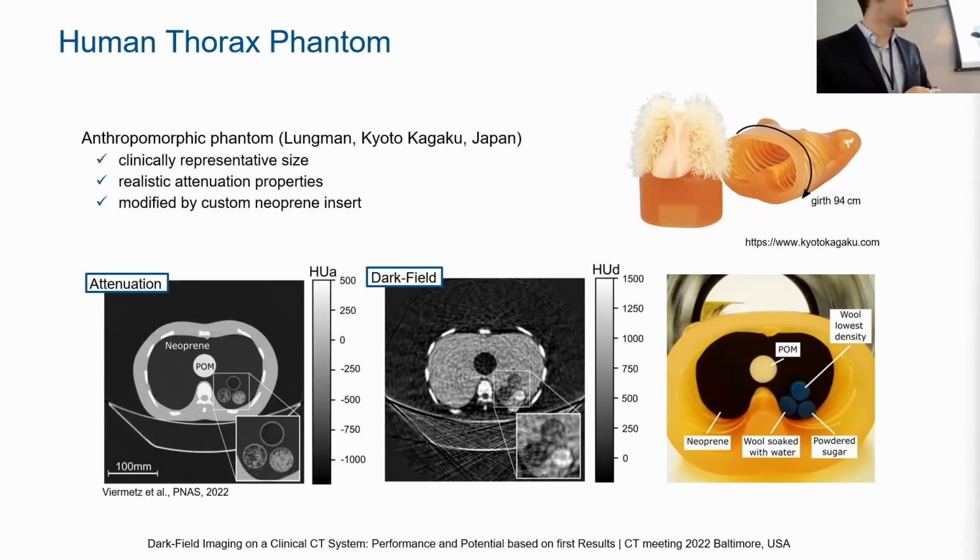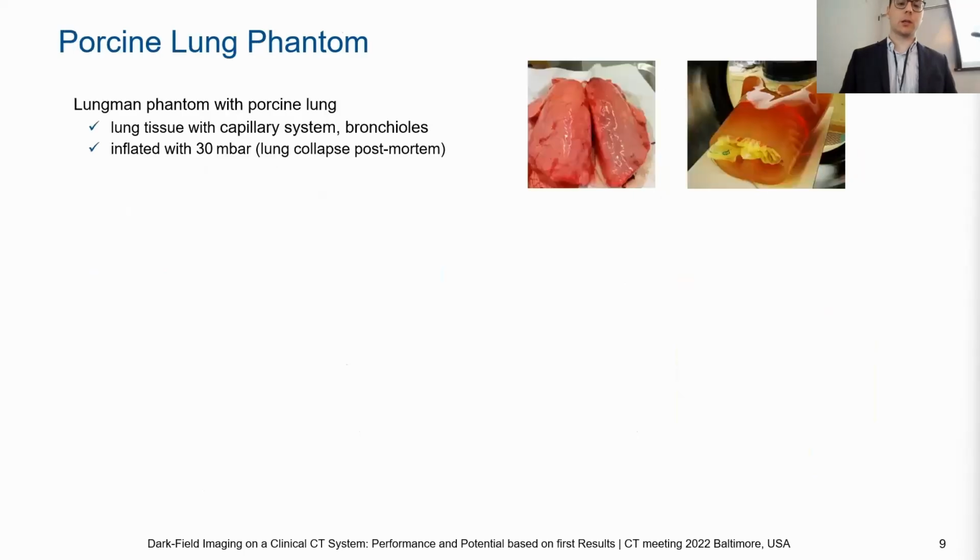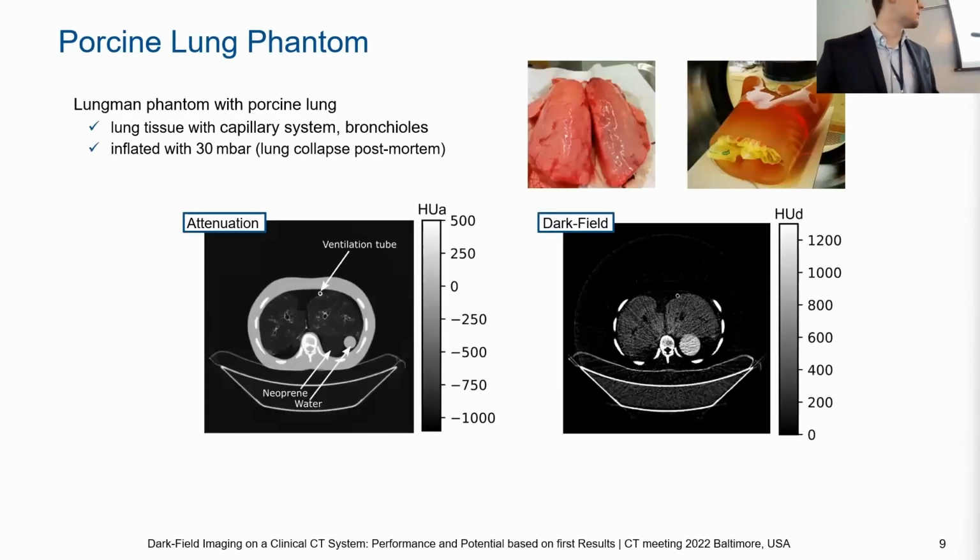And you can see this here, for example, in this early reconstruction. However, we improved our processing by quite a lot, I think. And here, for example, in this image, you can see that the table is not generating any streaks anymore, or significantly fewer streaks than earlier. And I think that in this regard, we are also more robust against movement, at least for a bit.